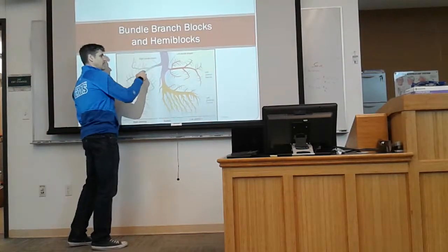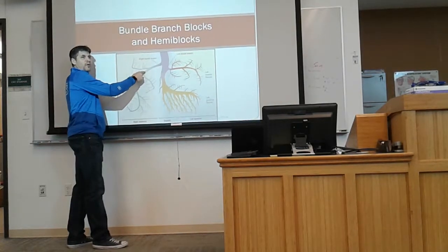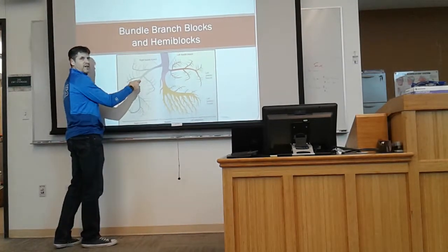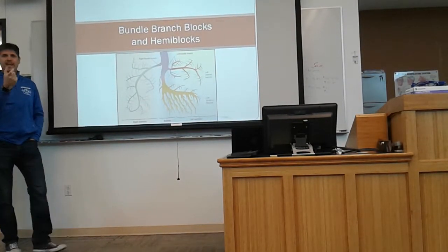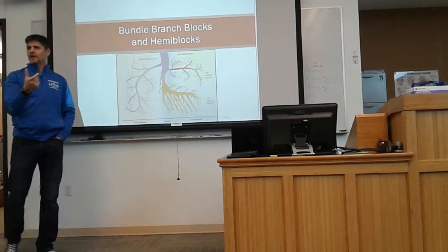But this was still depolarizing slower. And because this is depolarizing slower, we saw a QRS complex start, but then this starts to go and gives us a second QRS complex. Does that make sense? All tucked into the same QRS complex, but it seems like we have different QRS complexes.